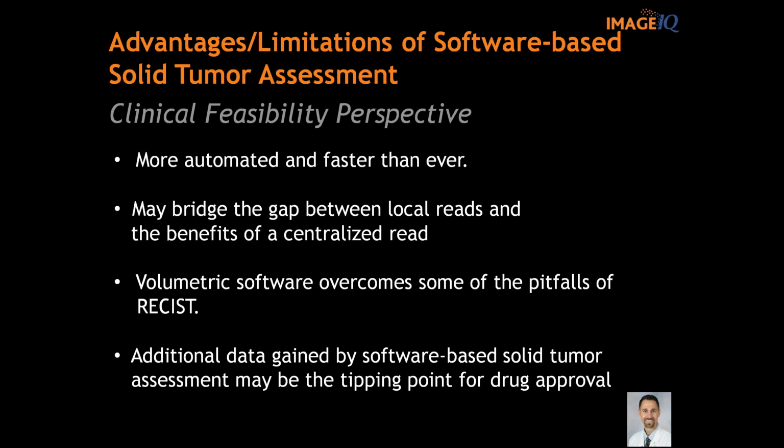It's called the Quantitative Imaging Biomarker Alliance, which started around 2007, and their task is, as the mission statement says here, to improve the value and practicality of using quantitative imaging biomarkers by reducing variability across devices, patients, and time.